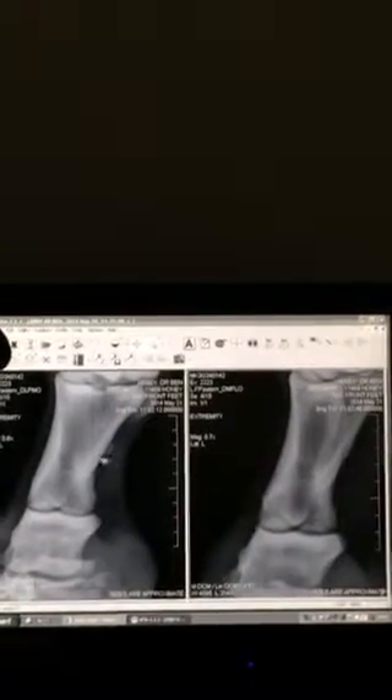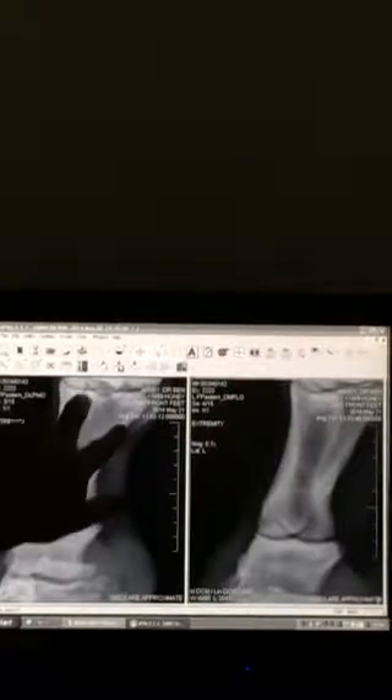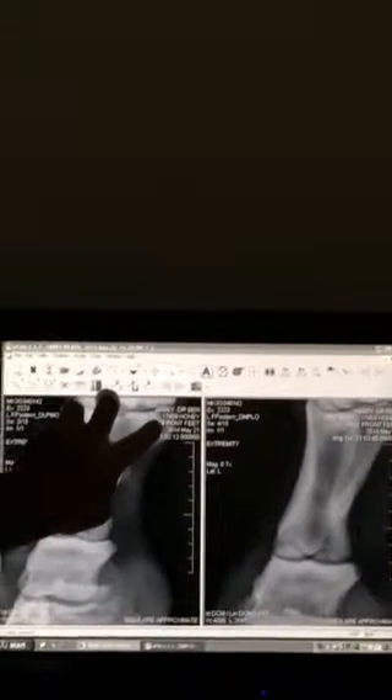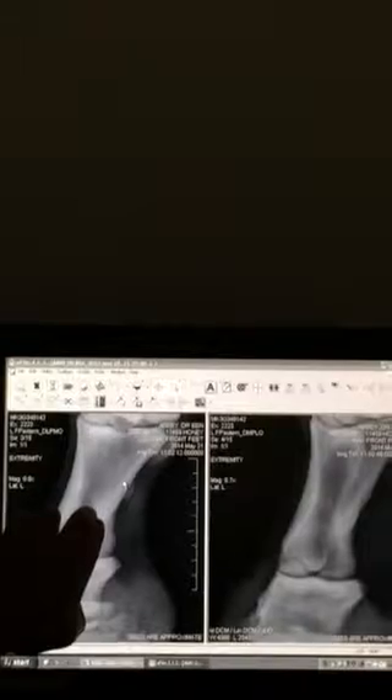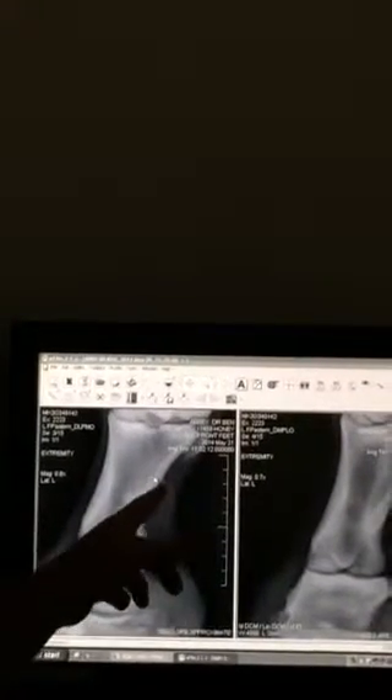Interestingly, on both sides — and I saw this on your films too — it looks like an old enthesiophyte, probably old, from a distal sesamoidean ligament. So there's the two obliques that come in B down and back at B1, and then there's the straight that comes straight down. That's an oblique insertion site.